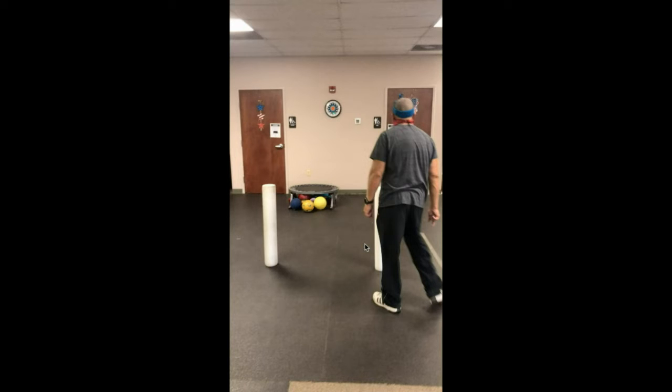These are common applications that we see on social media or in some educational series. And people mark these as, well, you're getting different parts of the vestibular system, the visual system, body awareness, mechanoreceptor integration, and of course, being able to turn with the head, neck, as well as the inner ear. And yes, those all check that box. But there are differences that we can understand with putting the visual feedback on that allow us to tie into where they're having their biggest changes.